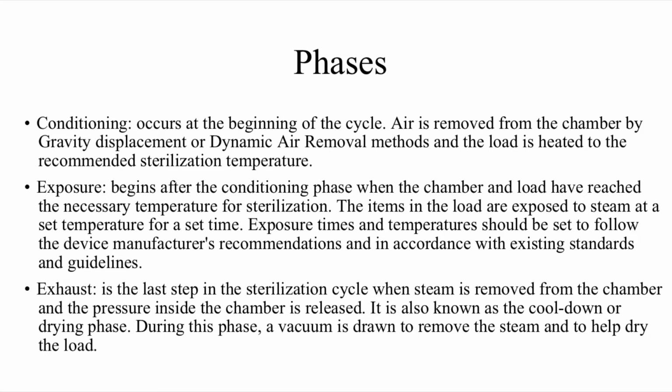Exhaust is the last step in the sterilization cycle, when steam is removed from the chamber and the pressure inside the chamber is released. It's also known as the cool down or drying phase. During this phase, a vacuum is drawn to remove the steam and help dry the load.